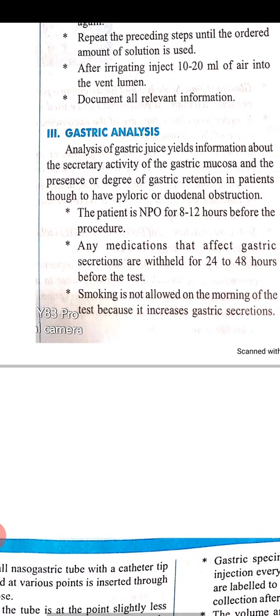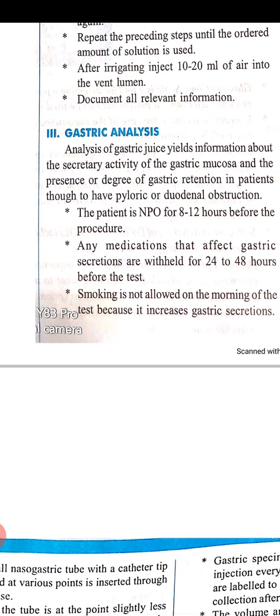Through the gastric analysis method, information about gastric juices comes.